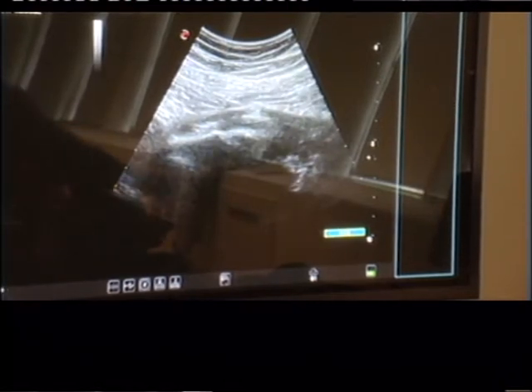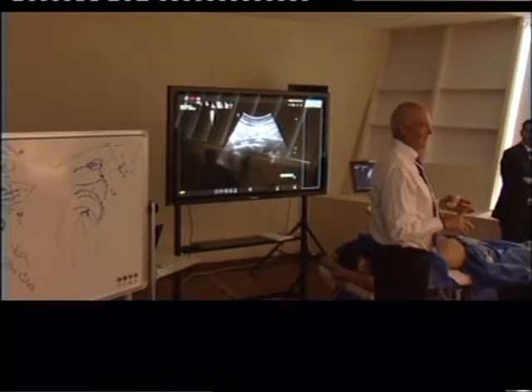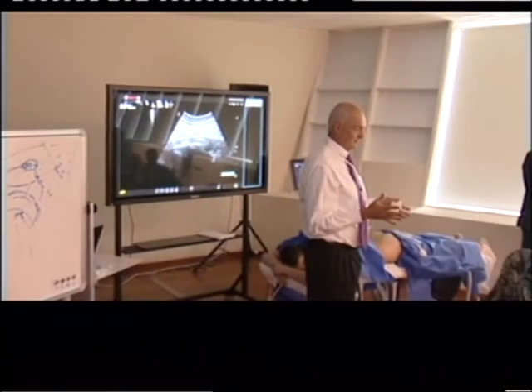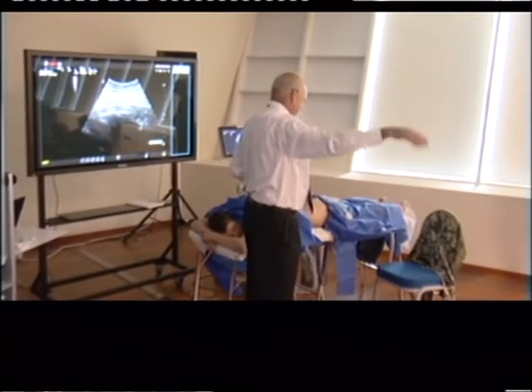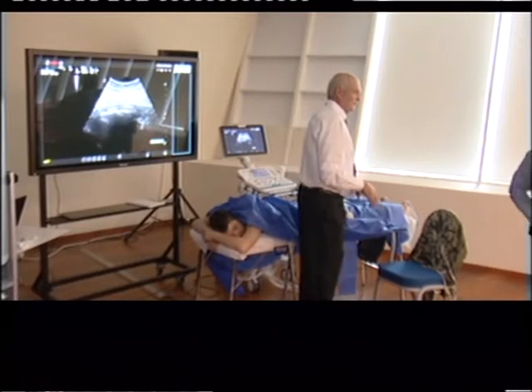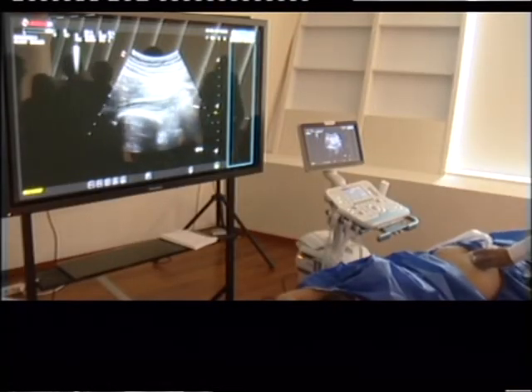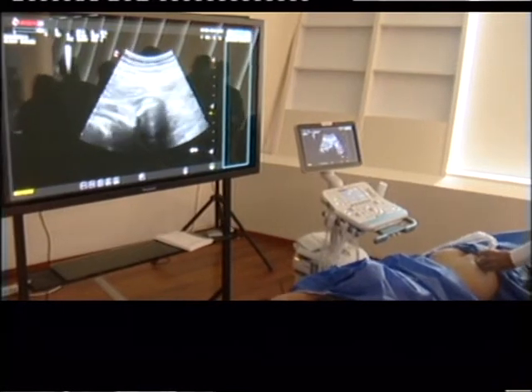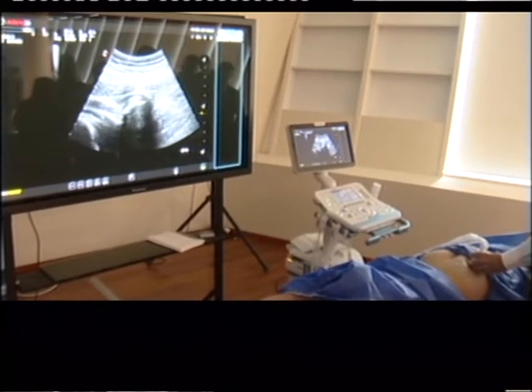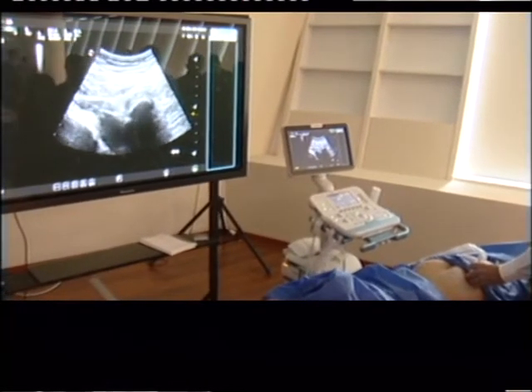So now we're going to go practice. We're going to do piriformis and pudendal. Obturator internus I think is important too. So, okay, let's go. Here's piriformis, and here's obturator internus, and then there's the conjoint tendon of the hamstring, and then quadratus femoris and obturator externus.